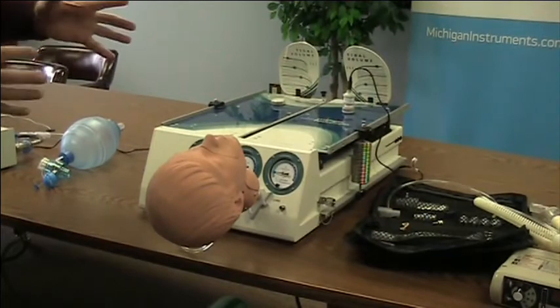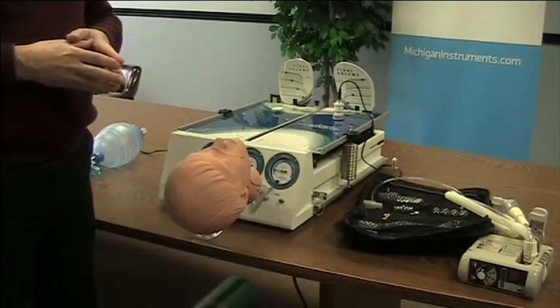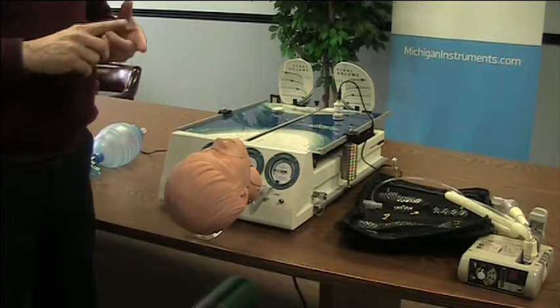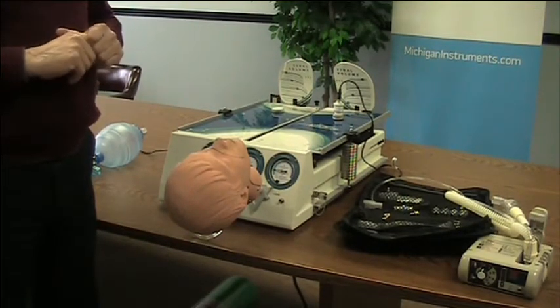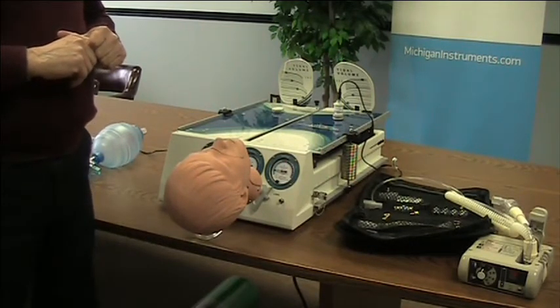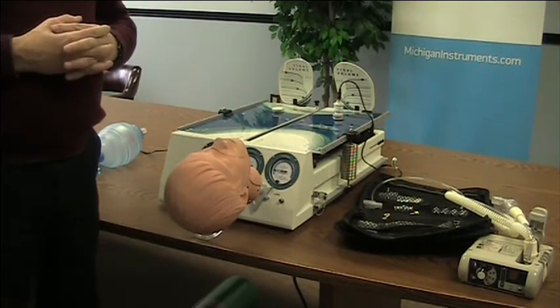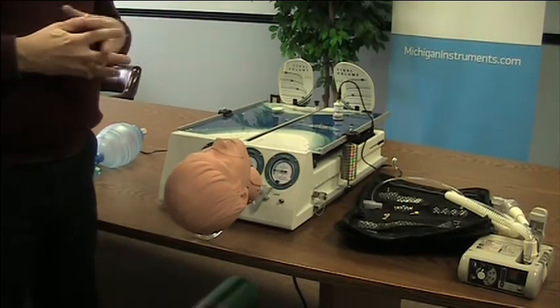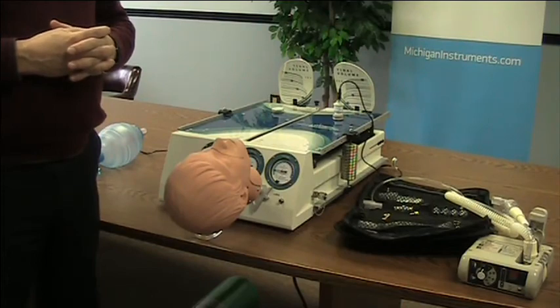That is a very quick overview and in-service on the dual adult TTL. We also offer an adult-infant TTL where you ventilate just one lung at a time, and a single adult lung TTL. Happy to answer all your questions. If you need additional information or have questions, please contact Michigan Instruments or visit MichiganInstruments.com. Thanks for your time.